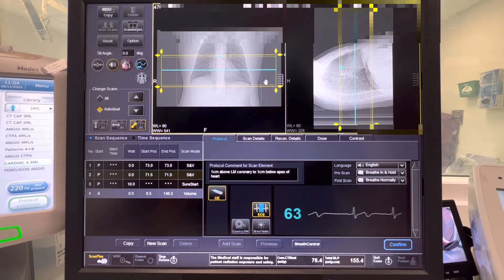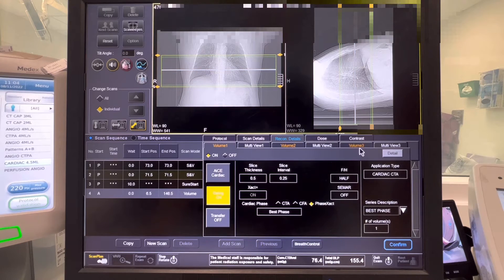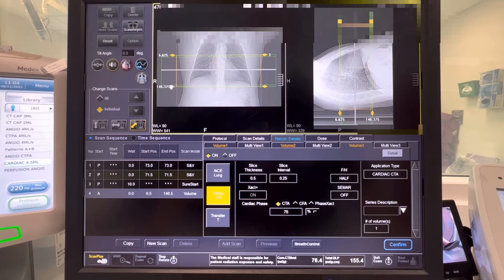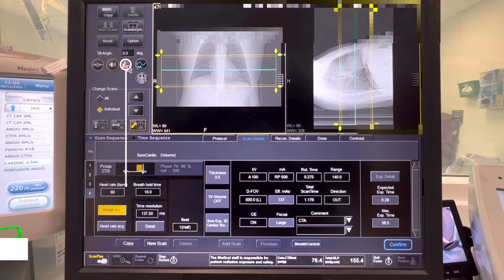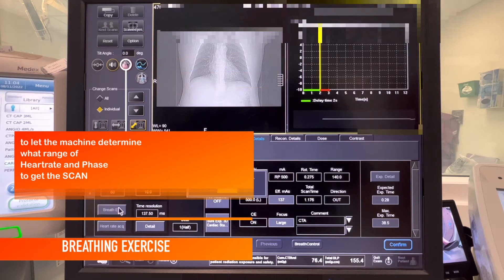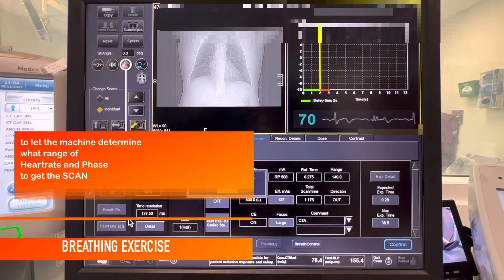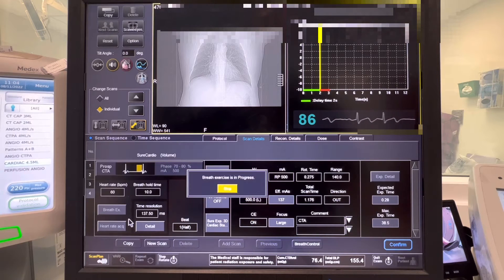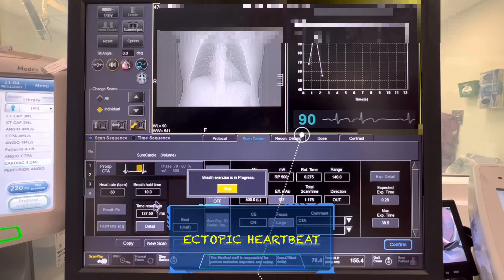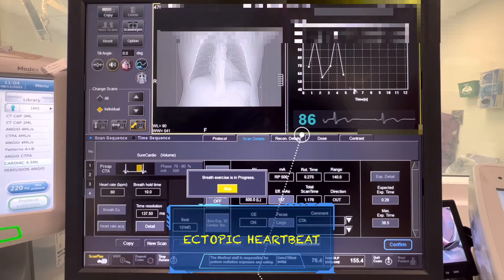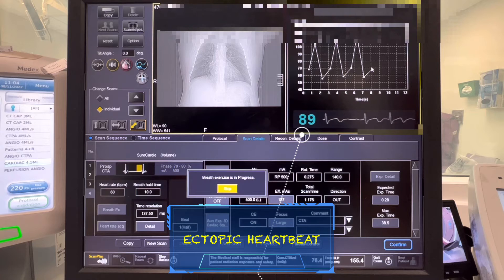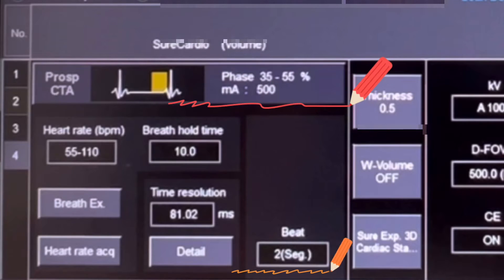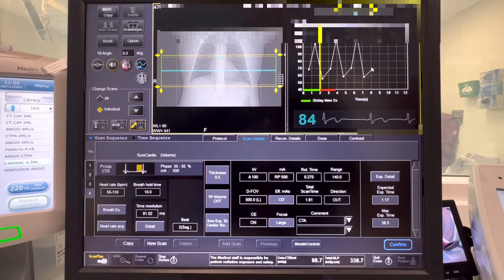Don't worry about collimating it for now because we'll do that as we go along with the planning. Click on details and go to volume 3 — this is the lung window, which is important for our radiologist to check any lung pathology. Collimate it a bit, then click the breathing exercise icon to let the machine determine what heartbeat and scan phases to use during acquisition. The patient is having an irregular or ectopic heartbeat, which may cause motion artifacts on the scan. These are the phases and beat segments the machine chose, but we are going to manually change the parameters as per our cardiologist's choice.